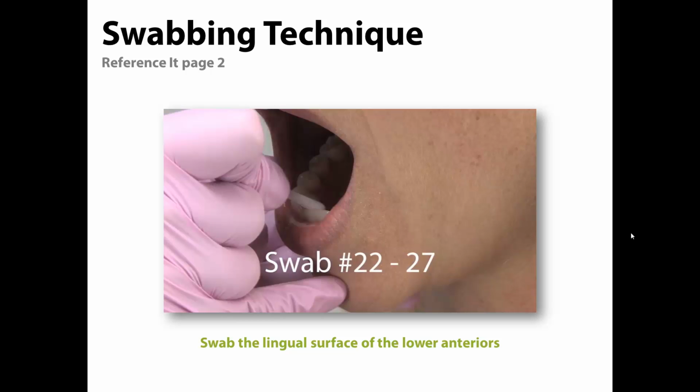If patients have a lingual bar, you can wedge the swab between the teeth and the bar to pick up biofilm from both surfaces. And it's okay to swab false surfaces, like partials or dentures, because the biofilm is the same no matter the surface. And if a patient is missing teeth and there is no partial, simply move the protocol back in the mouth, and make sure you're picking up biofilm from 6 teeth total, and stick to that lingual surface.